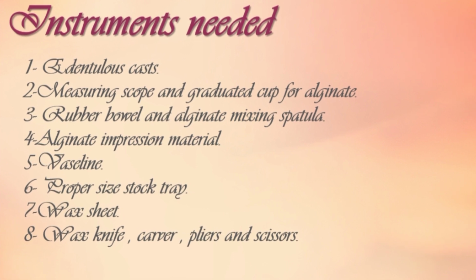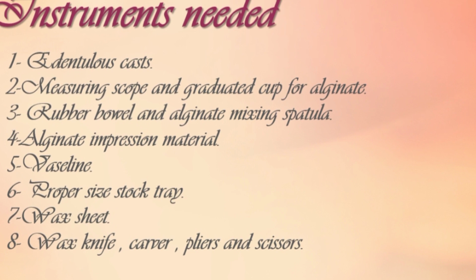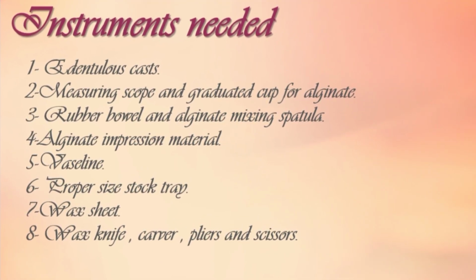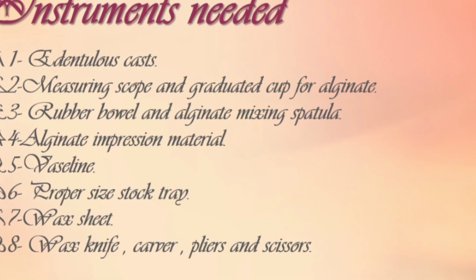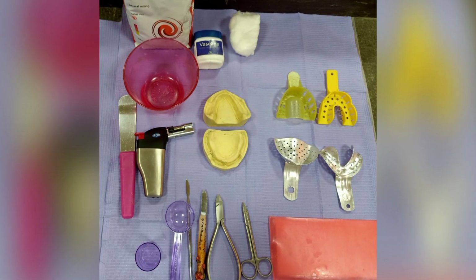Instruments needed: edentulous casts, measuring scoop and graduated cup for alginate, rubber bowl and alginate mixing spatula, alginate impression material, Vaseline, proper size stock tray, wax sheet, wax knife, carver, pliers, and scissors. These are the instruments.